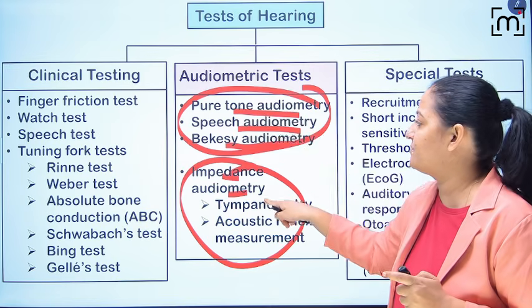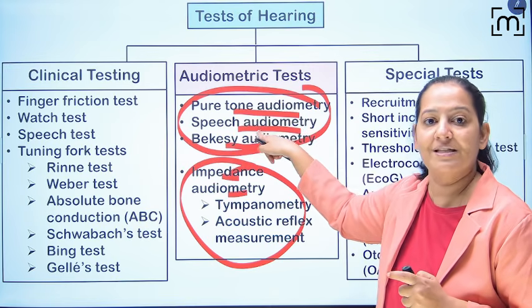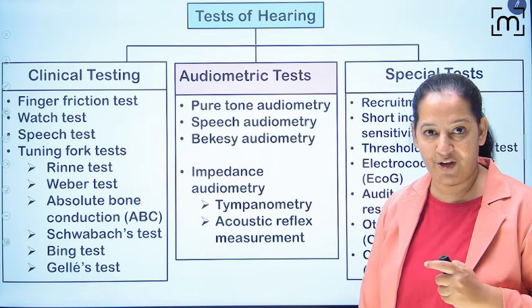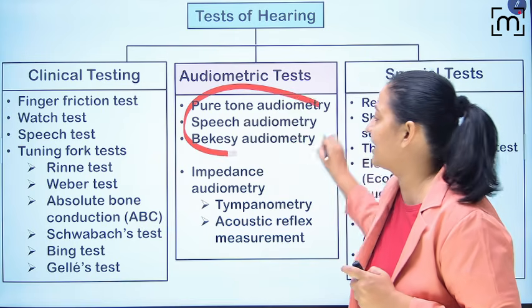So these 3 tests are subjective tests: pure tone audiometry, speech audiometry, and Békésy audiometry. I hope you are getting it. These 3 tests are subjective tests.